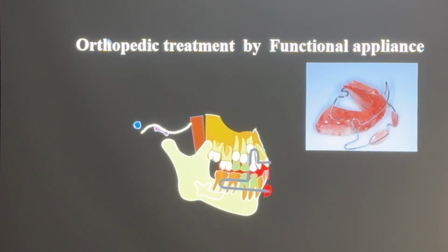And then the lower lip muscle will touch this area. But sometimes the lower lip force is too strong.